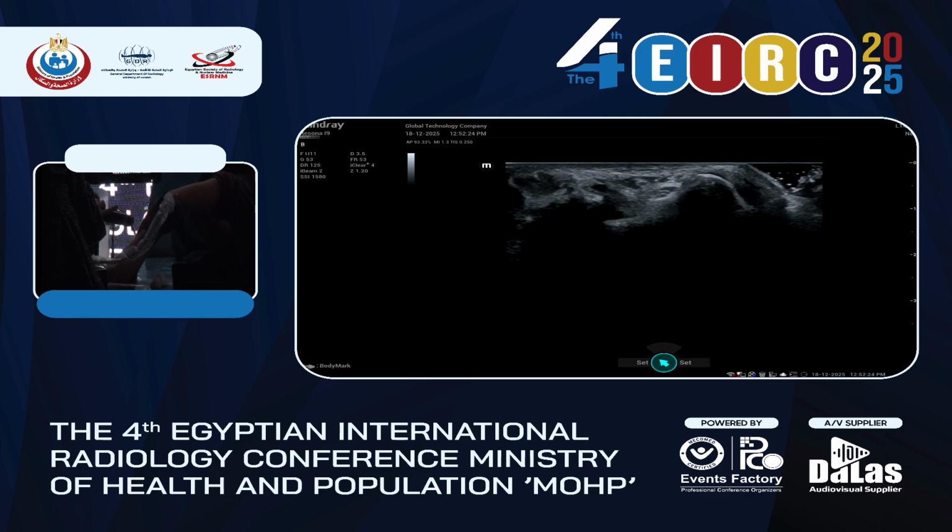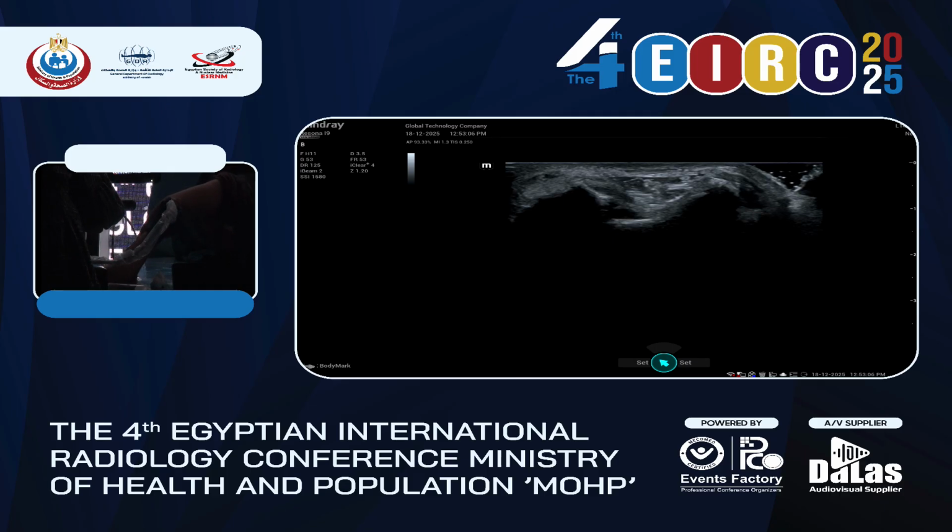The normal cross-sectional area of the ulnar nerve is 8 square millimeters in most people at that level. And if you have more than 8 square millimeters, you have to suspect that there is pressure on the nerve and edema of the nerve. But because there are a lot of anthropometric differences in the sizes of the nerves, you always have to ask the patient whether they have symptoms, because they might have an ulnar nerve which is bigger, completely normal, without any symptoms. And also you need to check by comparing to the other side to see if the nerve is symmetrical. So with these two considerations in mind, we report the presence of enlargement and cubital tunnel syndrome.